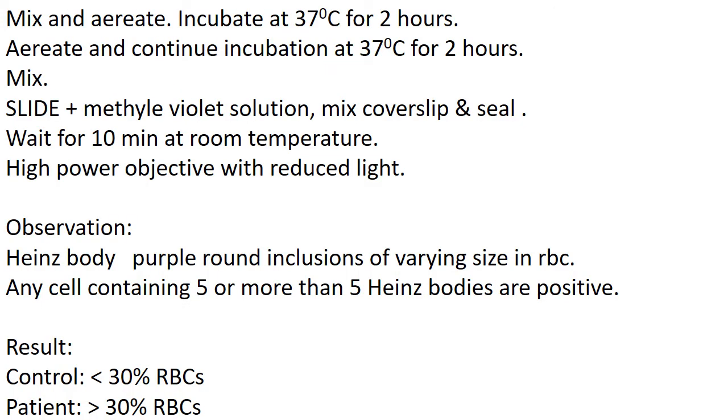Mix and aerate by blowing through the pipette a few times. That is called aeration. You provide air. Incubate the tubes in a 37 degree centigrade water bath for about 2 hours. Repeat aeration and continue incubation for another 2 hours.